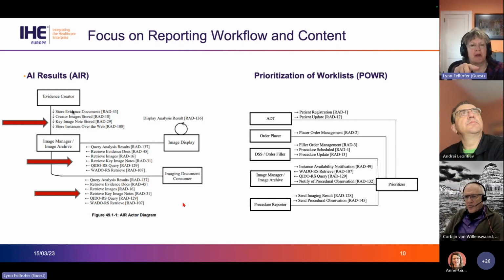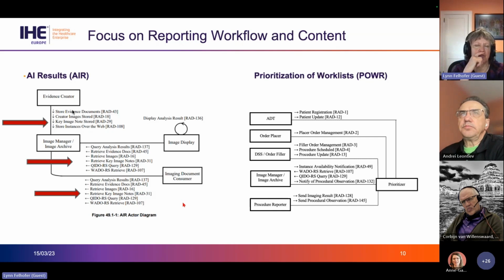Yeah, the only other thing I'll point out here, the reason for the red arrows, and we'll see it in the next slide, is there's been a move in IHE Radiology to incorporate the RESTful DICOM transactions for query and retrieve of imaging and information. The list of transactions both on the left hand and the right hand side for exchanging looks long, but there's an alternative for both: choosing the DIMSE, the traditional DICOM exchange that's been implemented and deployed for many years, as well as the RESTful transactions.